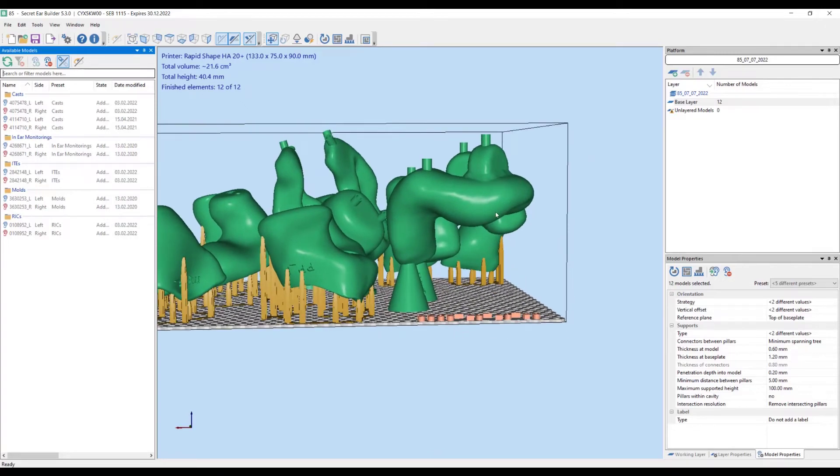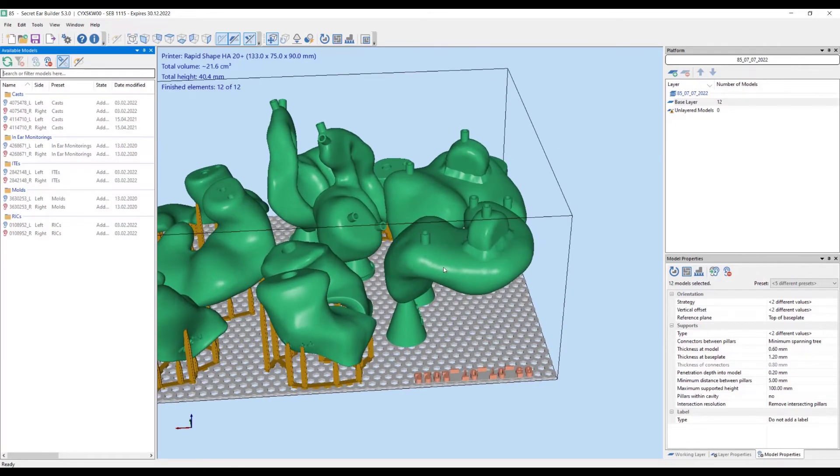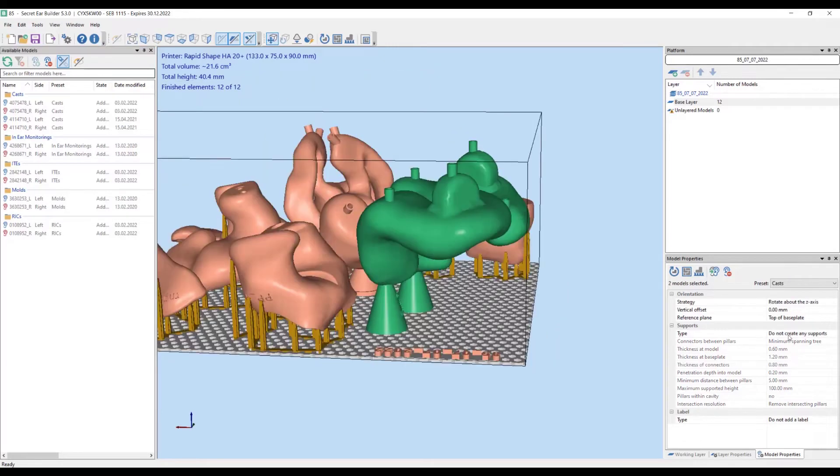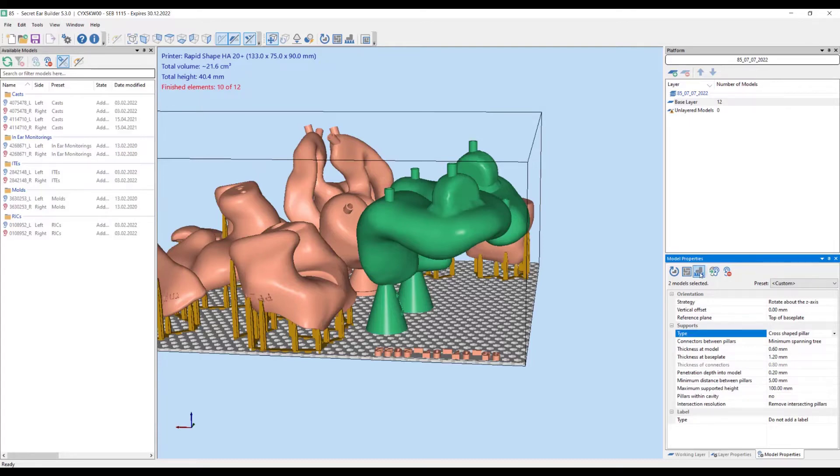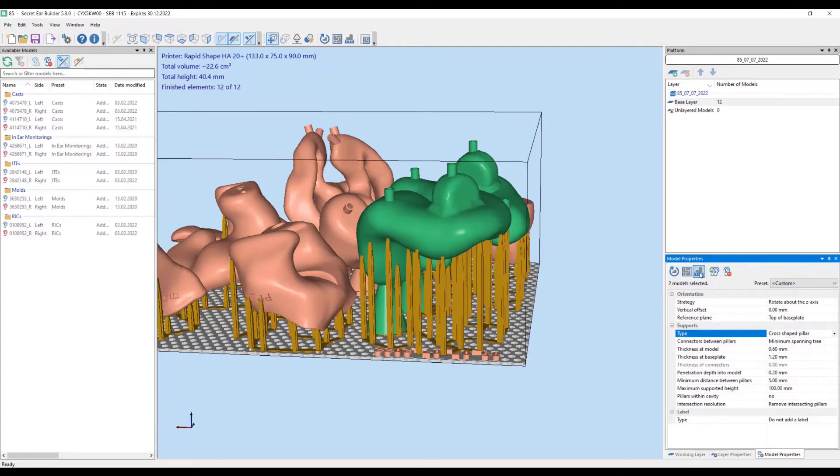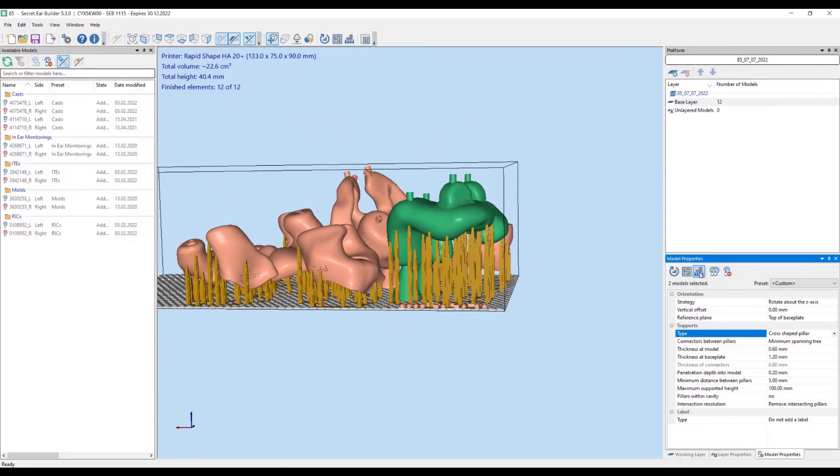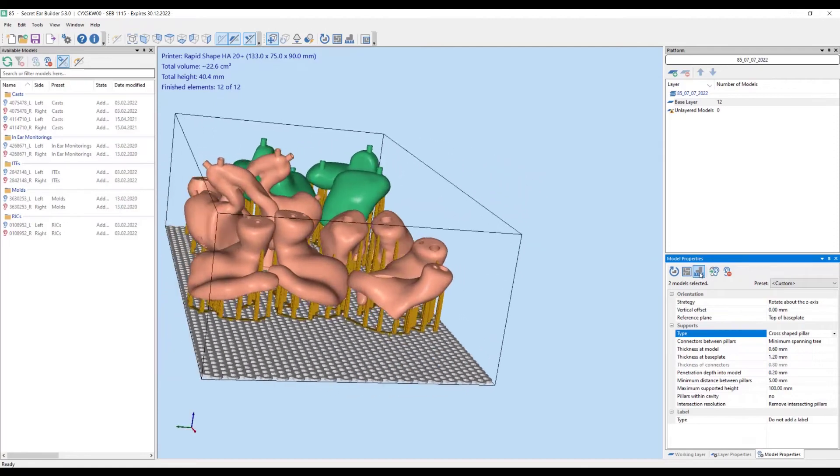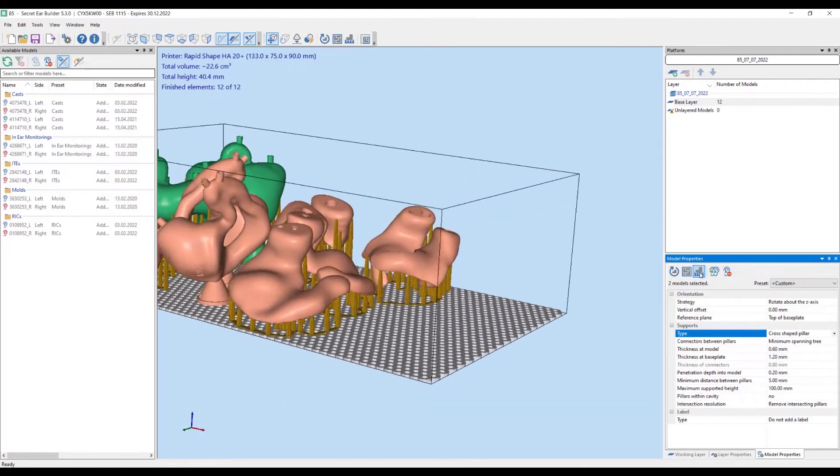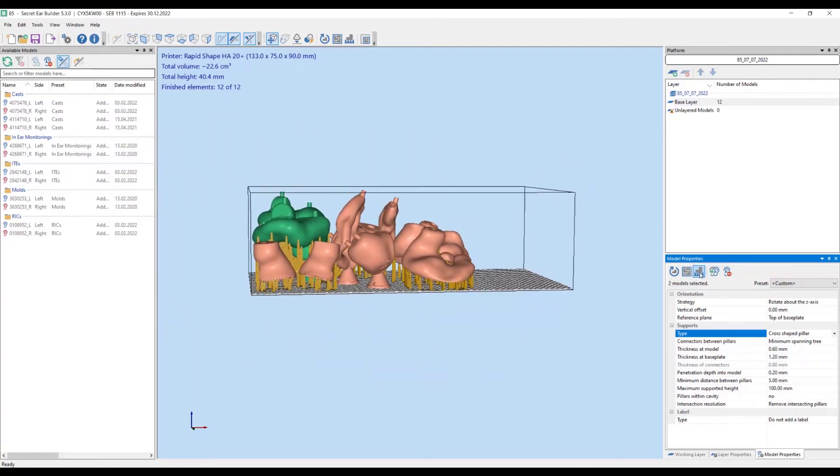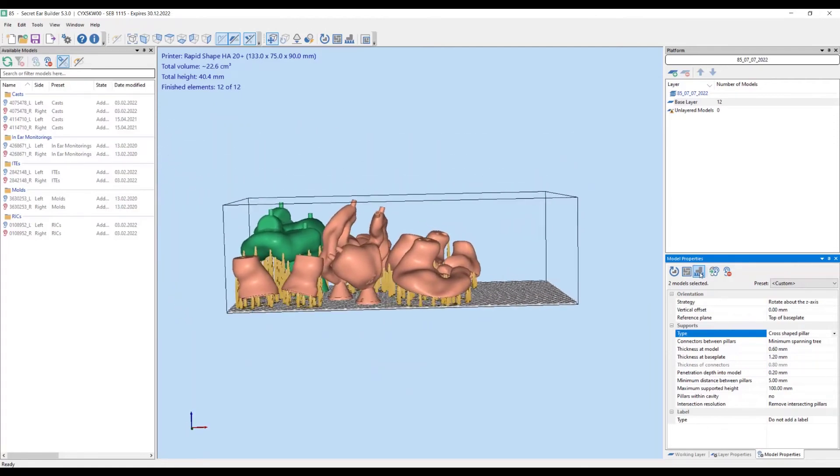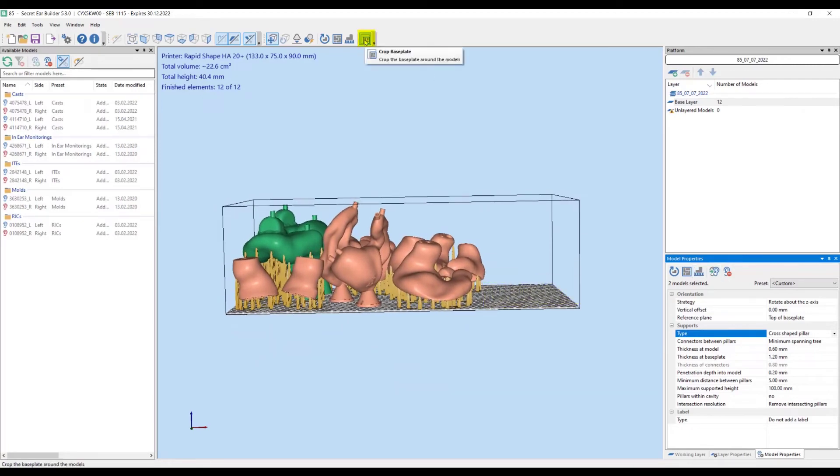The injection mold models standing on their cones extend outward. These overhangs need to be supported. We choose the support type and launch the function create supports for the active models shown in green. Since the platform is not full, we crop it to save on resin.